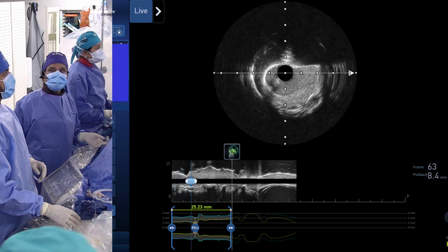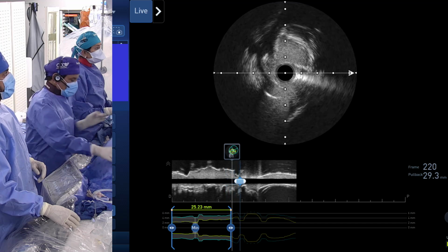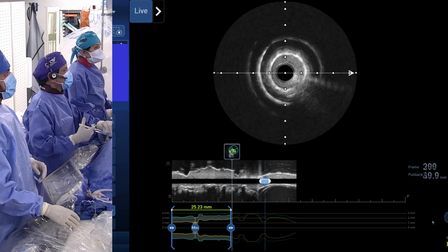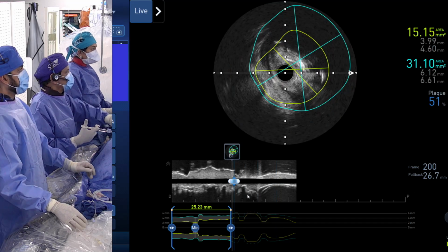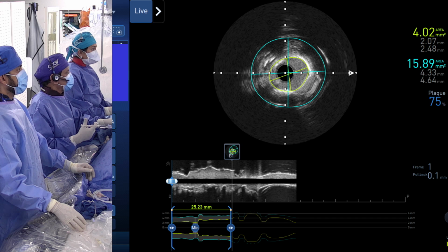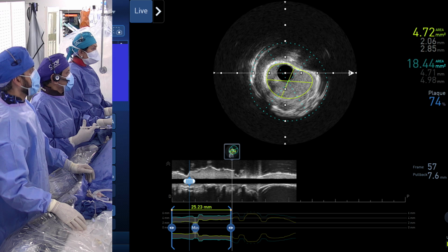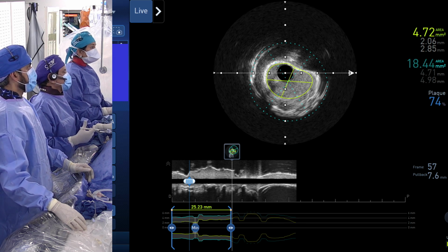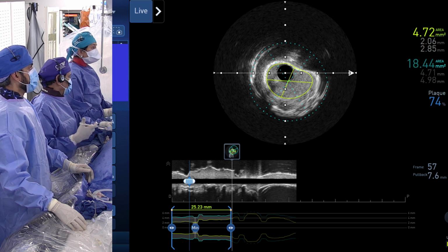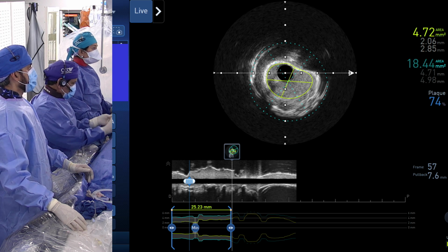So this segment of the LAD has ring calcium, and the lumen is almost 4 millimeter square, so small lumen. Stop there. If you go to the proximal LAD, just scroll it down towards the left side. Here you see the calcium is not fully cracked and the lumen is around 4 millimeters square. The vessel is almost more than 4. But the calcium looks thin, because we can see the vessel behind the calcific plate also, so probably the balloon will crack it. This part of superficial calcium looks thin, ma'am, because we can see the vessel behind.